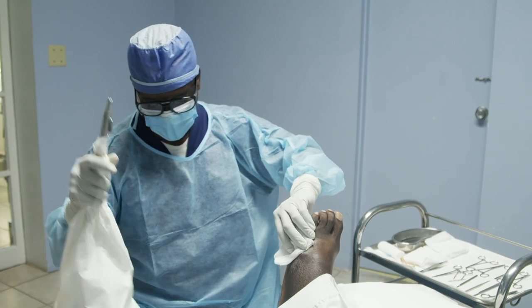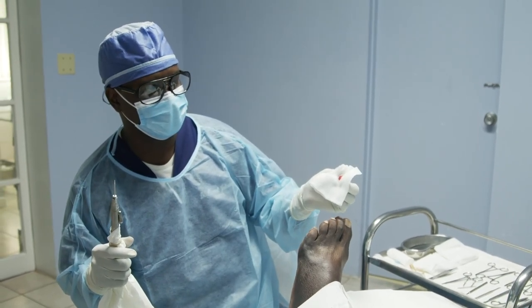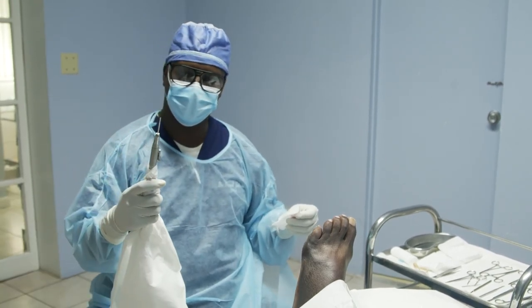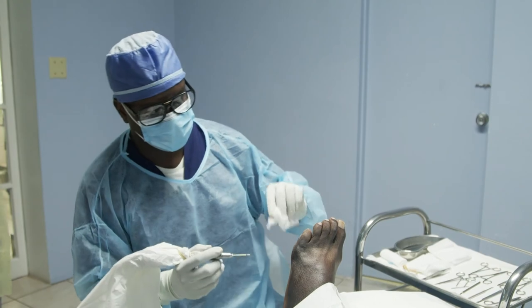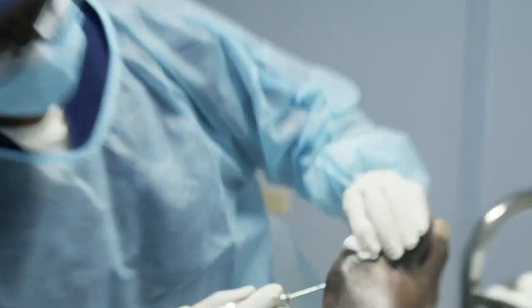Well done. So with MIS surgery, you don't have to worry about blood loss. That's what you're going to get. We're in the joint. This burr now is an oscillating bone file. It's an OSADA drill. It goes inside the joint. And I use it just like a pen. So I'm now going to draw around his joint a little bit. Right?